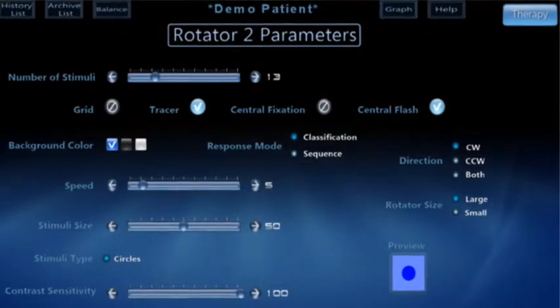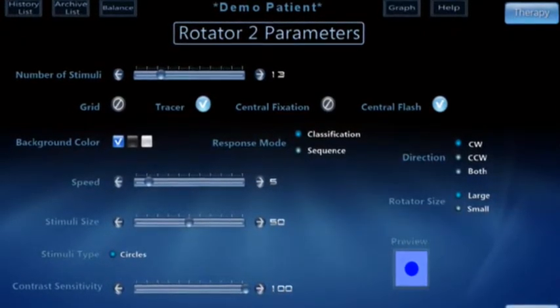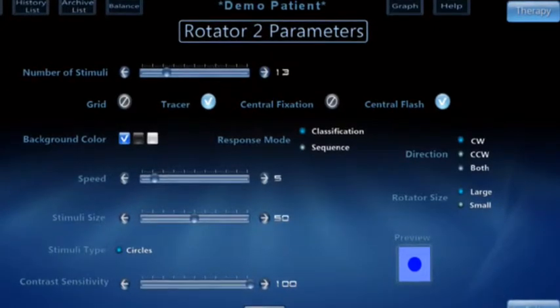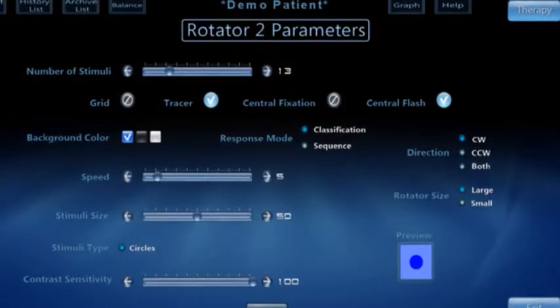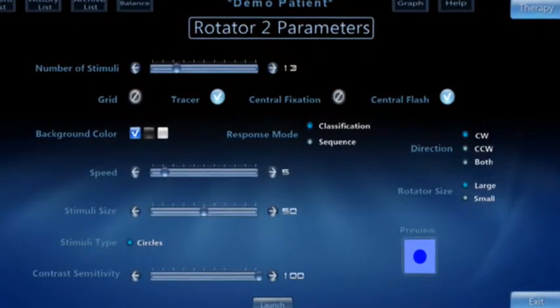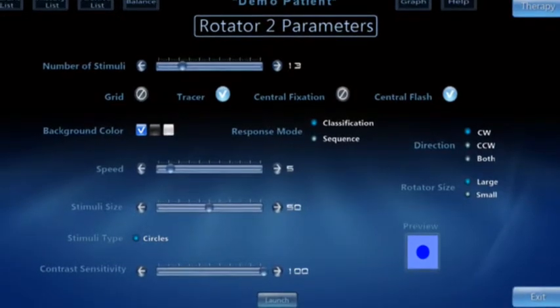Here are the parameters for Rotator 2. You can change the Response Mode from Classification to Sequence. Classification is when the patient has to match all of one color, then all of the next. Sequence is when the patient has to match the colors in a specific order, such as red, white, blue.